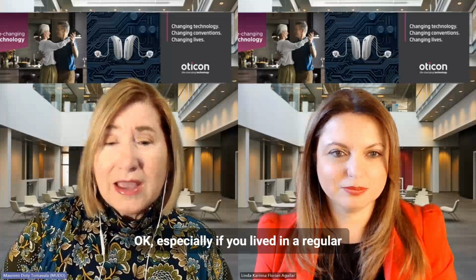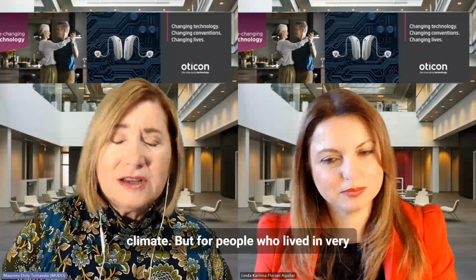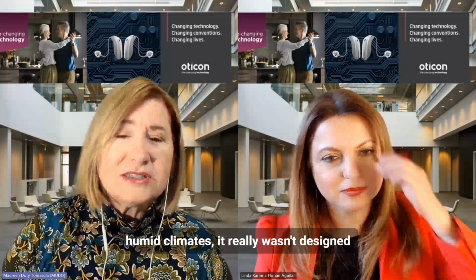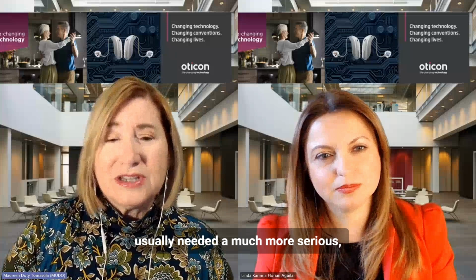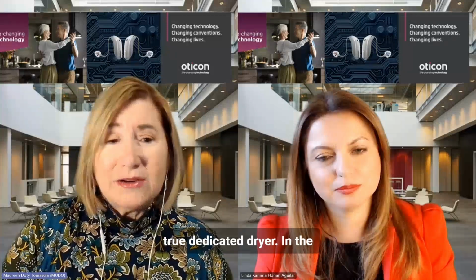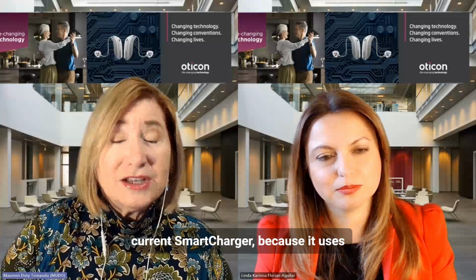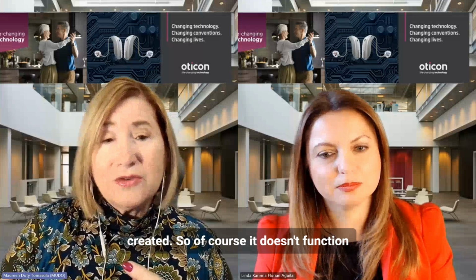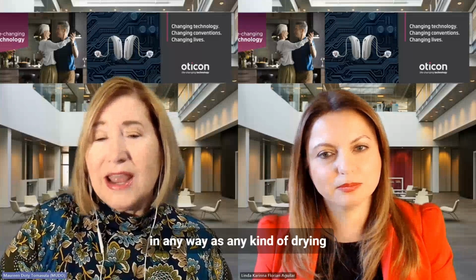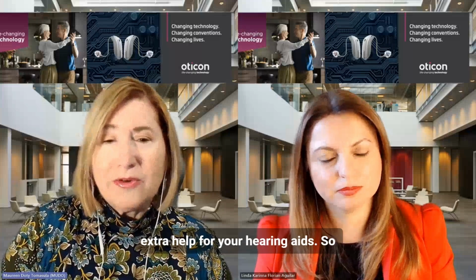And that was okay, especially if you lived in a regular climate. But for people who lived in very humid climates, it really wasn't designed to be a hearing aid dryer. So they usually needed a much more serious, true dedicated dryer. In the current smart charger, because it uses contact charging, there's no heat created. So of course, it doesn't function in any way as extra drying help for your hearing aids.